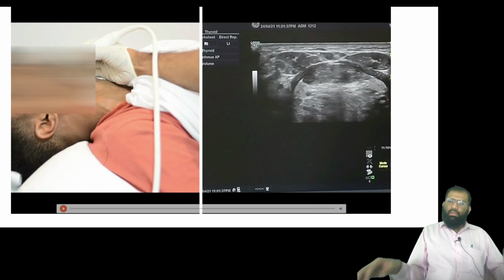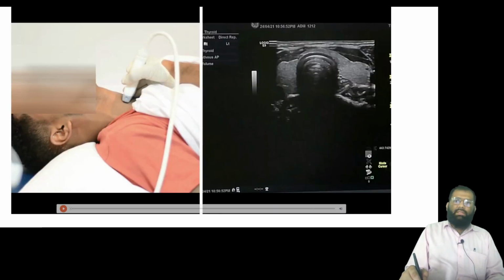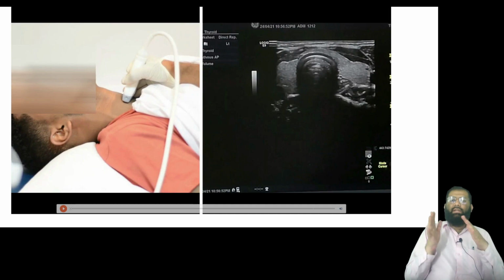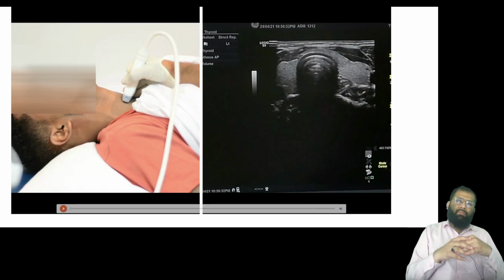Hope you have enjoyed. You understood what the technique of ultrasound is followed when it comes to USG of thyroid gland. So what I want you all is to go through this recorded session again and again, revise it, also see my sessions on thyroids, also see my sessions which I've made on neoplastic lesions of thyroid, thyroiditis, diffuse thyroid lesions, and all of this will help you to be very sure in thyroid pathologies, and you will be a fantastic sonographer when it comes to thyroid pathologies.